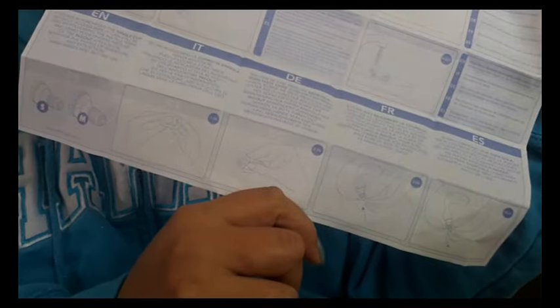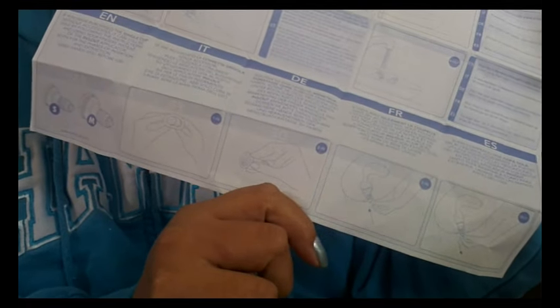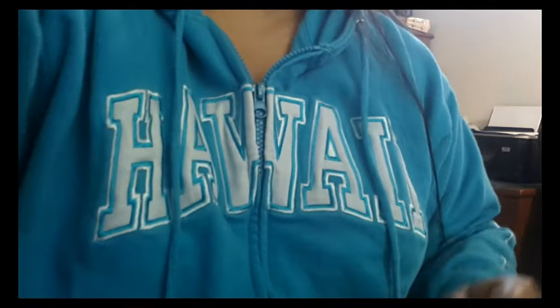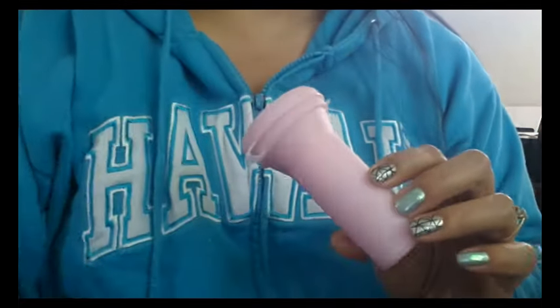It also has some pictures of the cup. You can use it without the applicator — in fact, it is sold without the applicator. Also, the applicator is sold on its own if you lose yours or maybe you change your mind after having just purchased the cup itself originally.